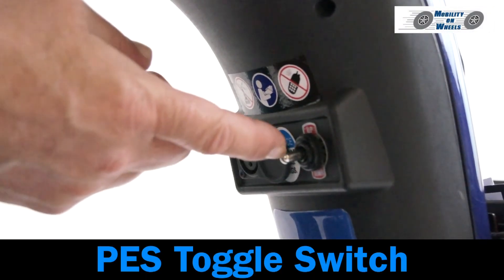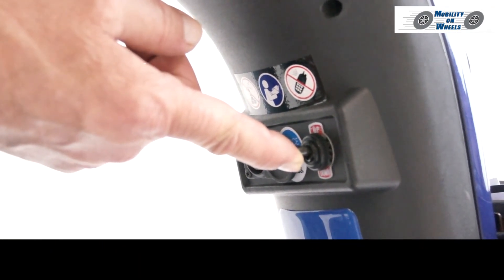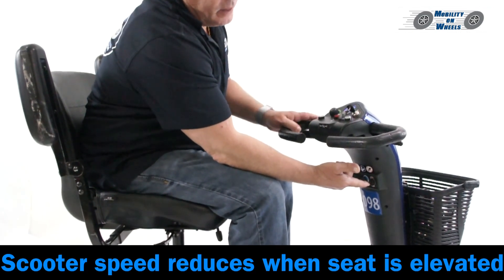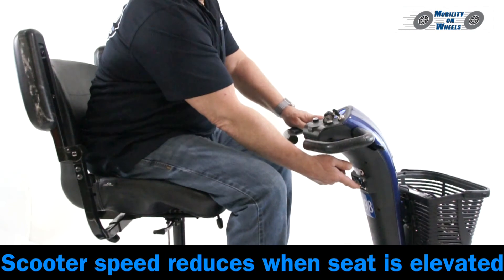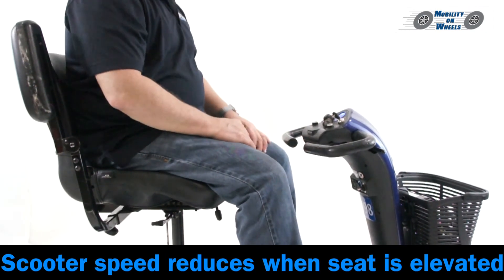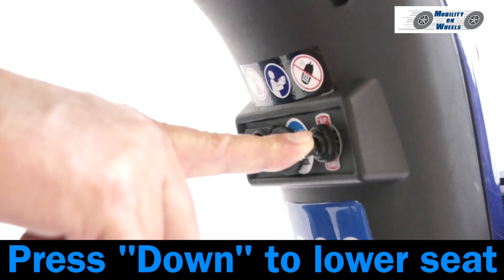Power elevating seat. Some units may include this feature — limited supply. Use the power elevating seat toggle switch: lift up and it will raise the seat. The scooter speed reduces when the seat is elevated. Press down on the toggle switch to lower the seat.